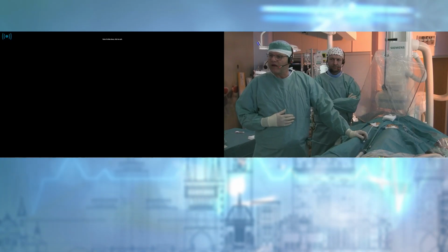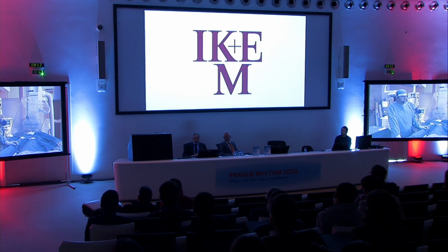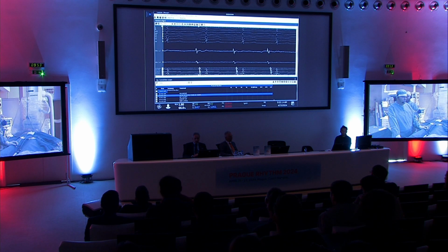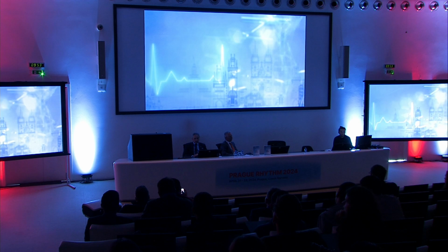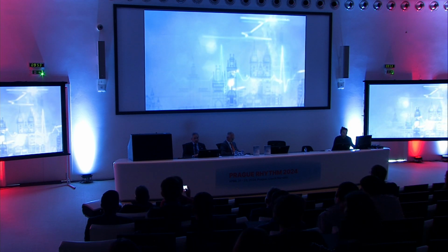Okay, so I say thanks for the introduction, for this suggestion of how you will do the case, and we will follow you in next entry to your lab, and we can switch to Roman to see how they proceed with neuroablation in a typical case of patient with neurally mediated syncope.